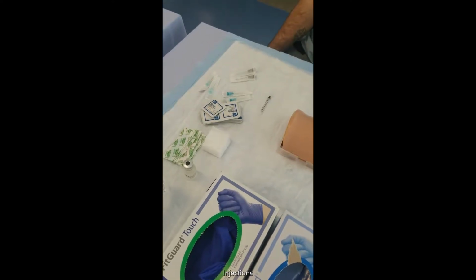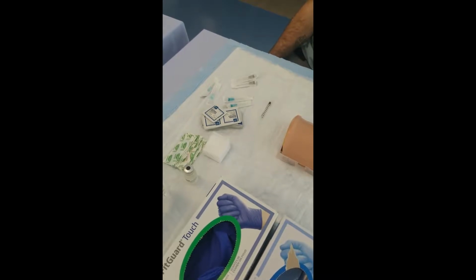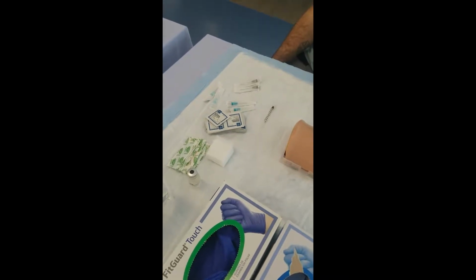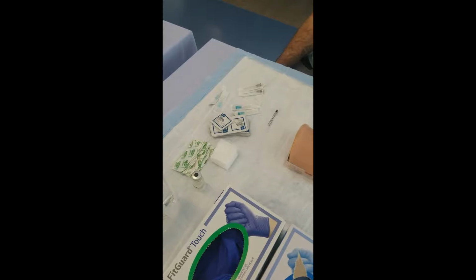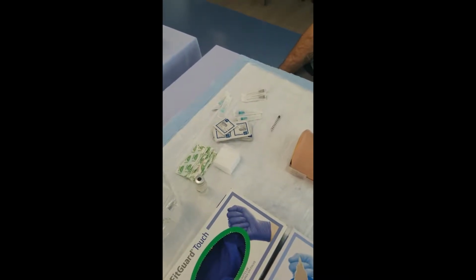Injections. Please note, students may leave the same pair of gloves on throughout all 3 injections. If student has already washed hands and put on gloves, they do not need to re-wash. Students must verbalize. Injections may be completed in any order.